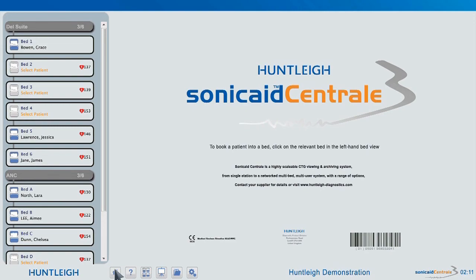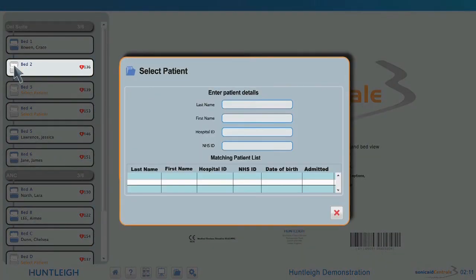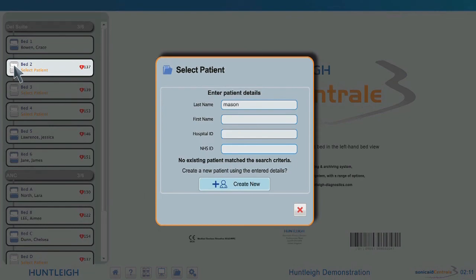Simply click on bed 2 to add the patient to bed. Enter the patient details in the relevant box. If the patient has been on the system before, or the system has the operational HL7 interface, the details will be found after typing in partial details. Select the required patient if they are listed. If the patient is not found after entering the details, click the create new button to add the patient to the database.